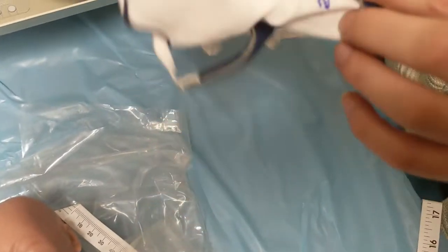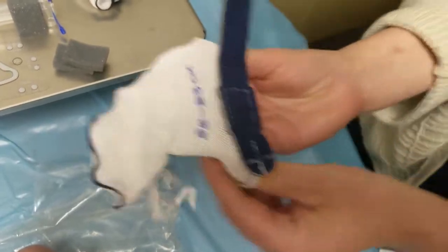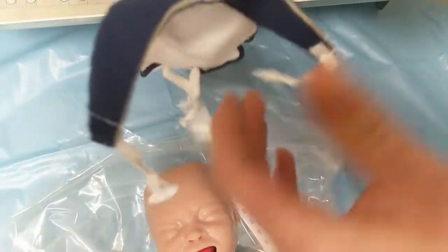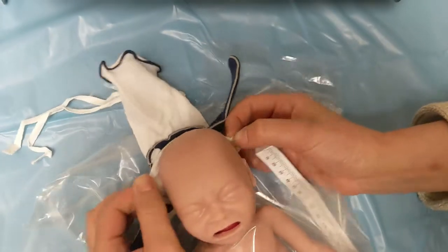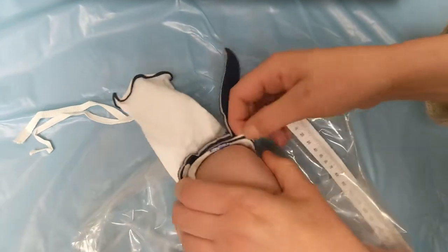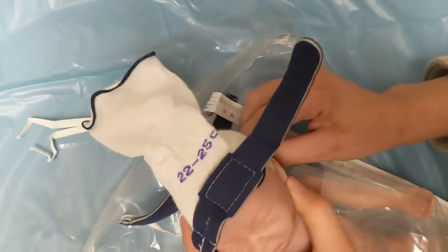It's already been through a little bit, but when you first start, you'll sort of open it up to stretch it out a little bit. These tabs go into the back. We'll just gently place it on baby's head. This baby has a pretty sticky head, so it's a little harder.